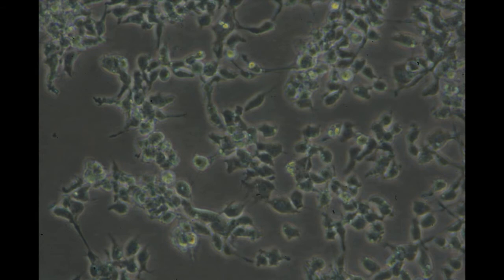This is an example of cells that are around 50 to 60% confluent, which means approximately half the area of the flask is occupied by the cells, but there is still space for them to continue to grow and divide.